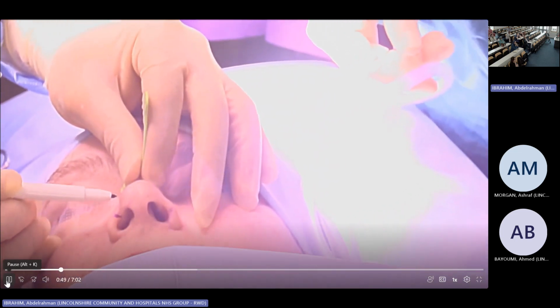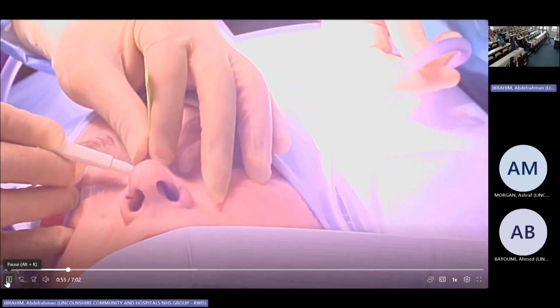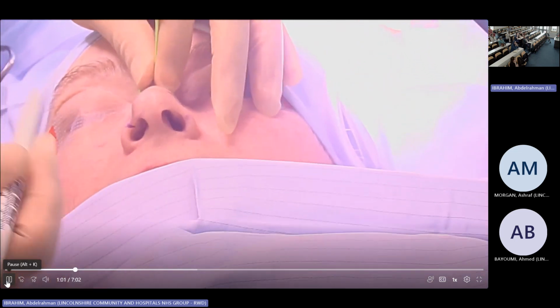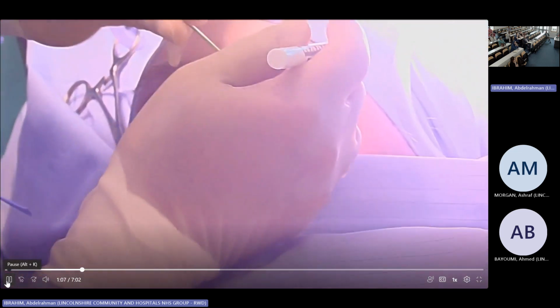It will come in the lateral there. So we have a top mark and a lower one as well. The top one is just over the midpoint of the nasal bone, and it's in line with the height's midpoint between the ala and the tip of the nose.